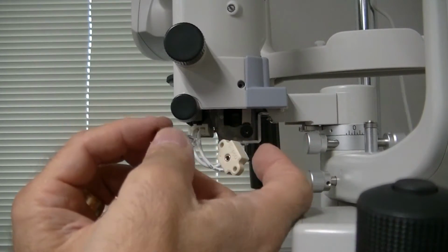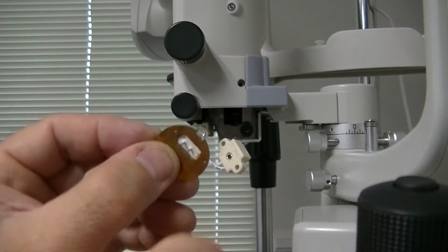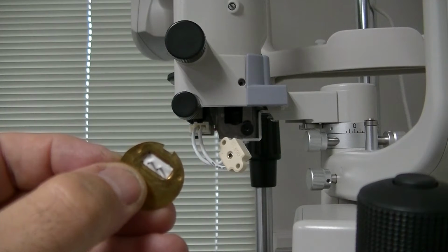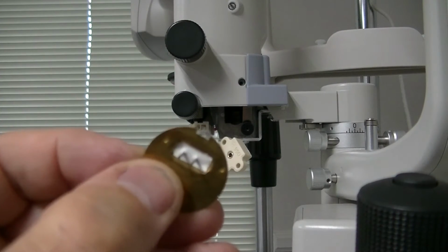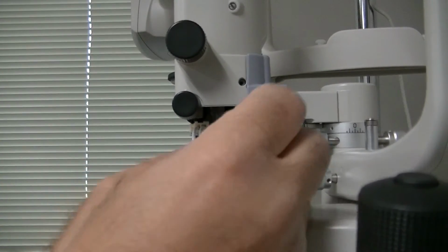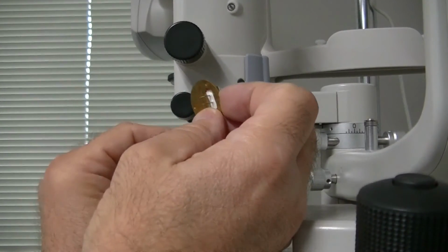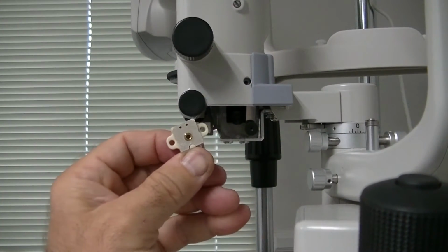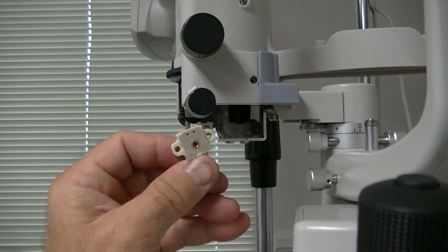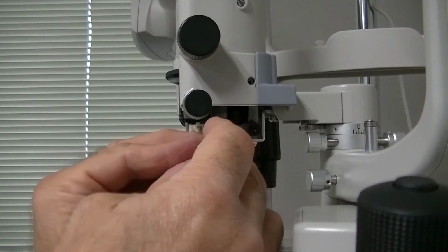Once you get the new bulb back in place, you see that keyway right there. Okay, that keyway has to go back towards the flat, non-wired portion of the lamp socket. And if you look at the lamp socket carefully, you'll see two holes there, right on the top of the middle there. Those two holes and these two pins go back together straight in like this.